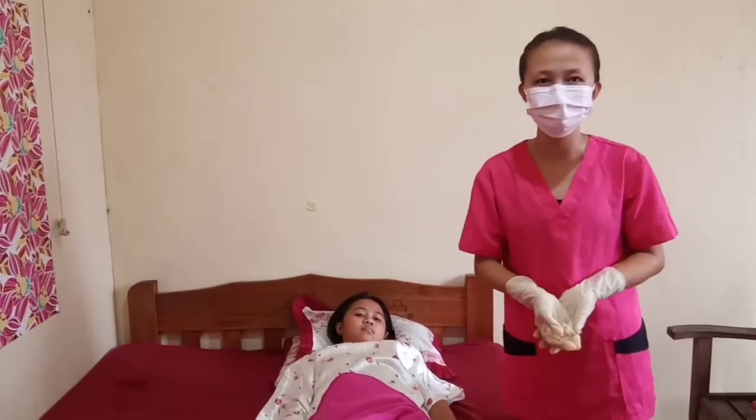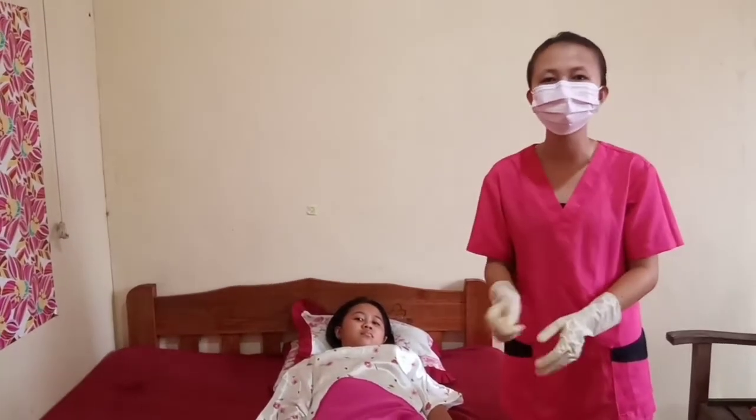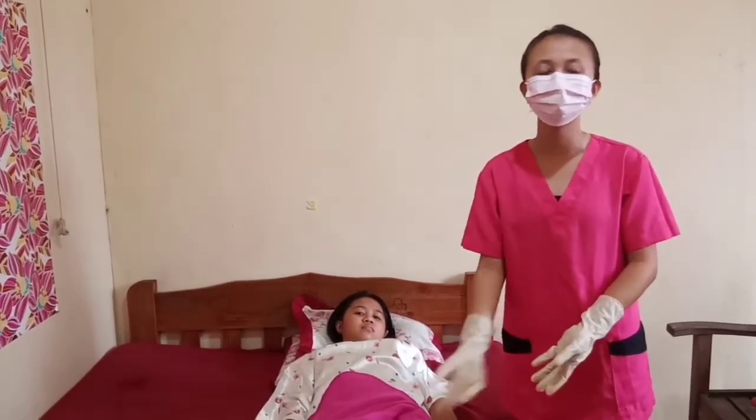So, if dressing sticks on a wet to dry dressing, do not moisten it. Instead, gently peel the dressing and alert client for possible discomfort.